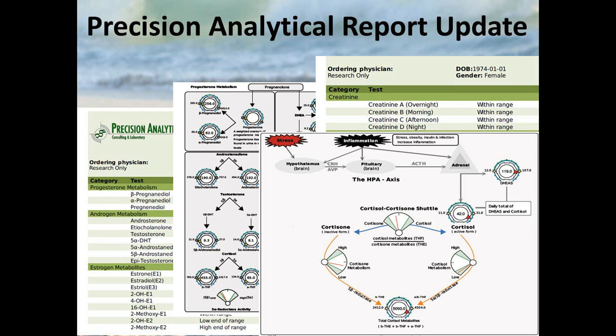This is a short video from Precision Analytical to update you on some changes we've made to our reporting format.